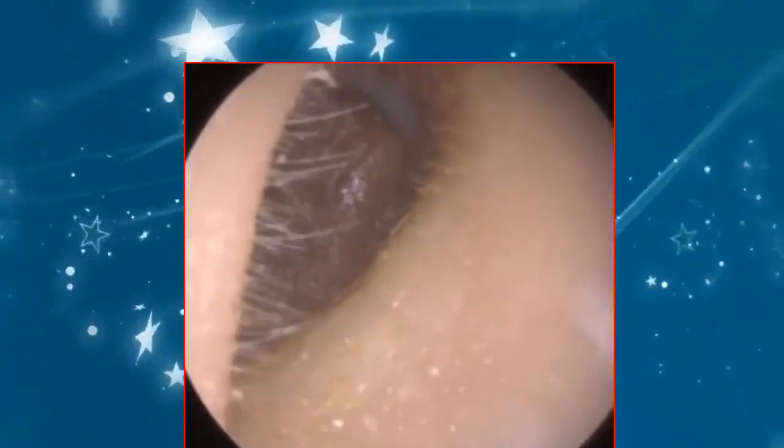So this is the patient's left ear. There is a bit of an opening just at the top. And in a moment I'm going to use the Jobson horn, but I think initially I'm just using the Zollner suction probe. And so in the case of the left ear, the posterior canal wall is to the right.